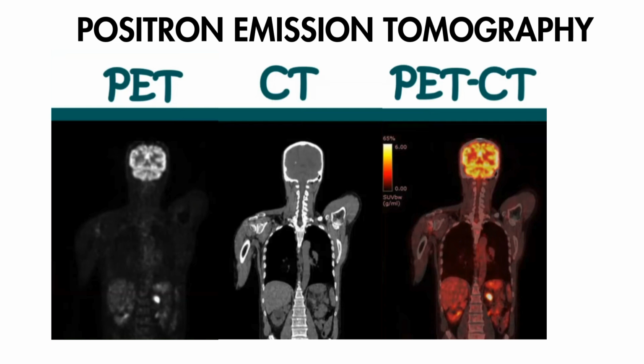So this is how positron emission tomography functions, and with this technology we can image all the metabolically active regions in the human body. This is how a PET-CT provides functional imaging. As we discussed earlier, functional imaging is the basis for cancer evaluation, Alzheimer's, myocardial infarction, epilepsy evaluation and coronary artery diseases.